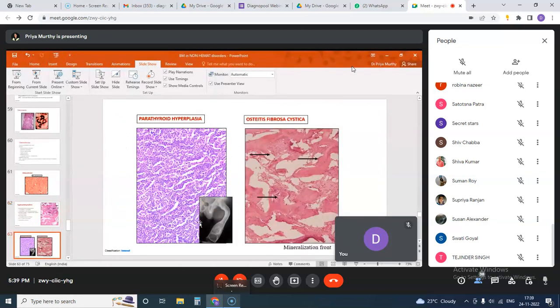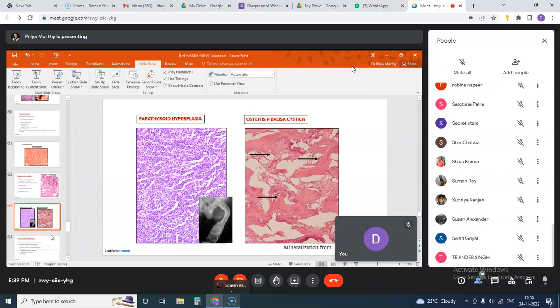a case of parathyroid adenoma, and subsequently after eating up, cysts form in the bony trabeculae, and these cysts are visible in the X-rays. So whenever you come across such kind of cases in a bone marrow biopsy, always insist on looking at the X-ray and take some clinical history on the patient.